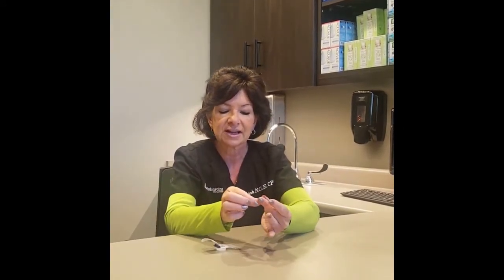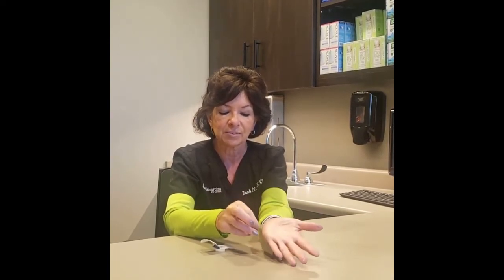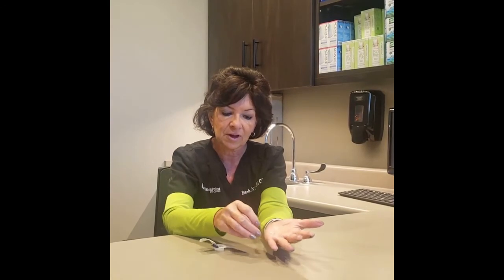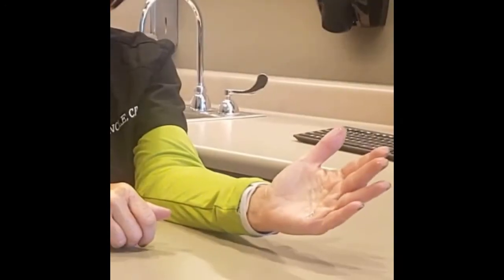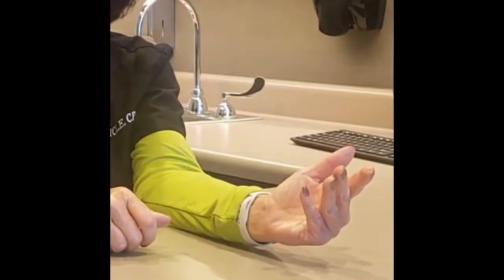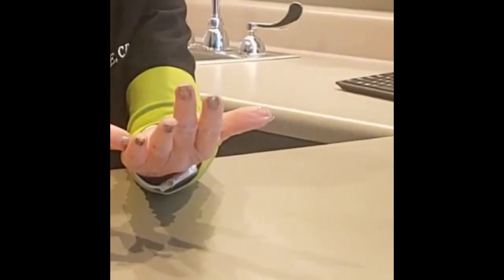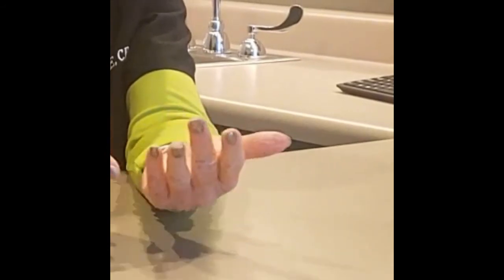This is called the taco test and basically what you're going to do is take the contact lens, center it in the crease of your hand behind your pinky finger, make sure all the edges are up and then if you just bring that pinky in, if that contact goes together like a taco, it's the correct way. If it does not go together like a taco where the edges kind of curl back out, then you know it is inside out.